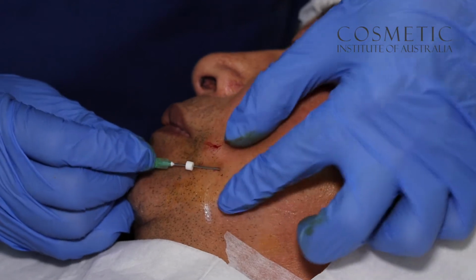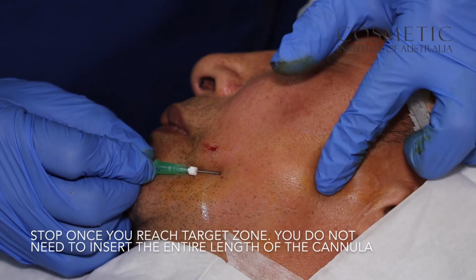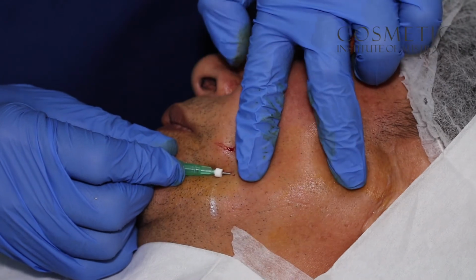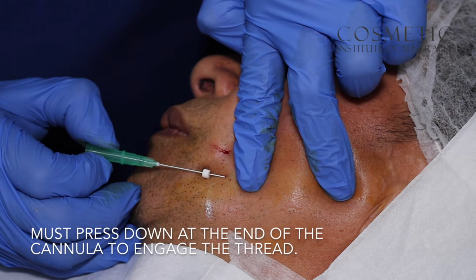The aim is to insert threads in the subdermal plane as superficially as possible. Stop once you have reached the target zone. Please note that there may be periodic resistance, especially on the lateral part of the face. This can be due to ligaments as well as scars.